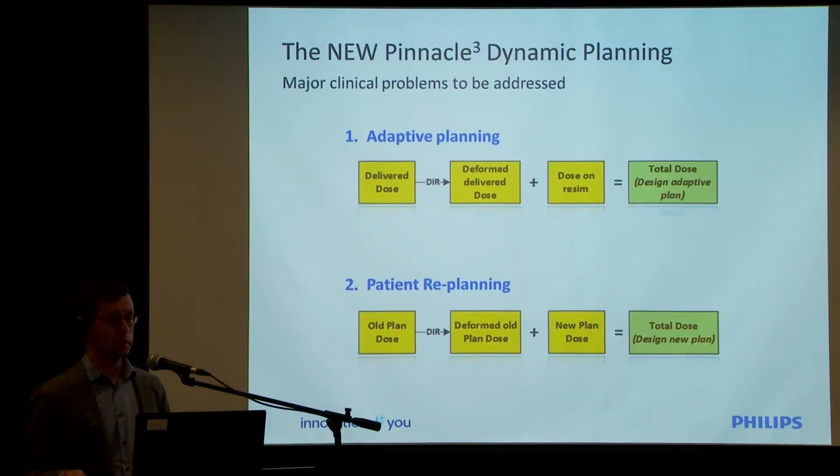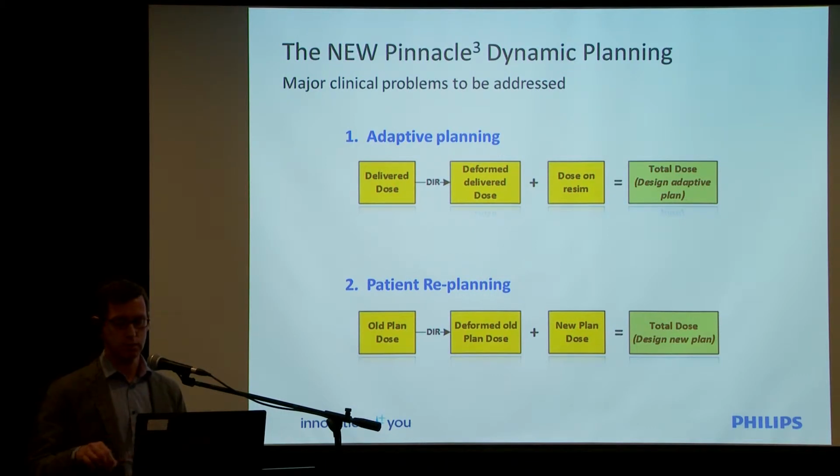The dynamic planning options, or adaptive planning options in Pinnacle, are designed to address two major clinical problems. One is adaptive planning. So we work with the delivered dose for the plan, the patient changes, and we want to deform that original dose to the new data set. So we can do that and sum or accumulate that dose onto the new data set. We can do that multiple times.